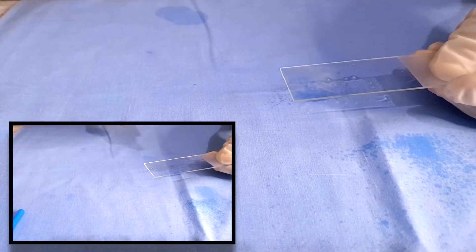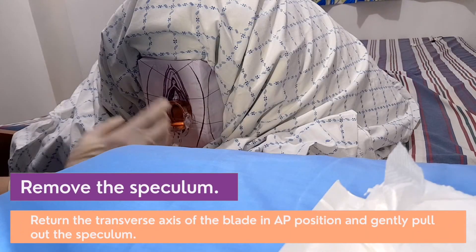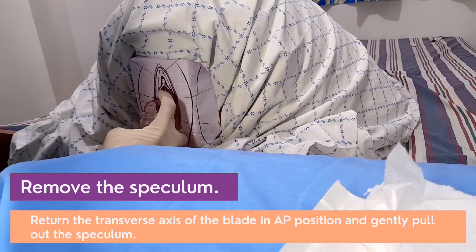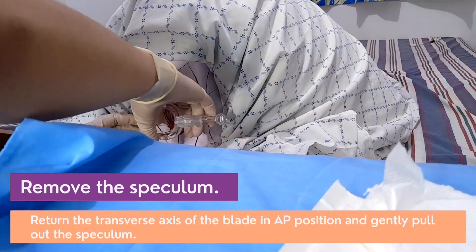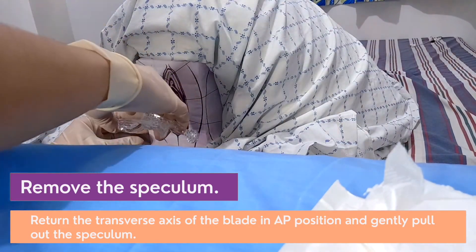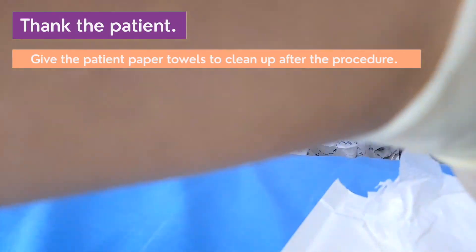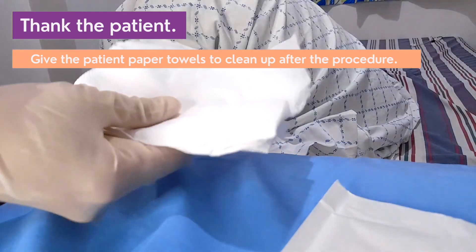Send the sample to pathology. Remove the speculum by closing the blades, returning to the transverse axis of the blade in the anterior-posterior position, and gently pulling out the speculum. Thank the patient and give paper towels to clean up after the procedure.